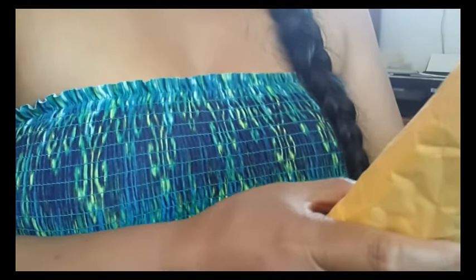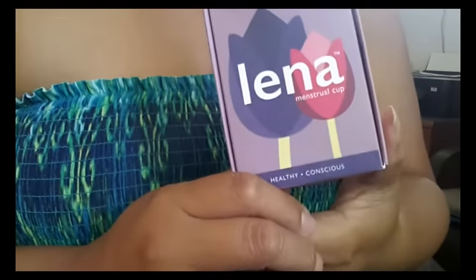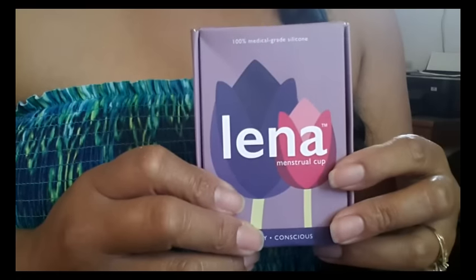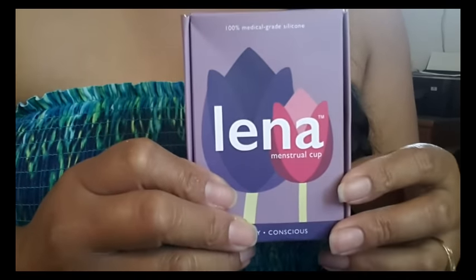I went ahead and opened the package and also cut the little sticker on the box but I didn't open it completely. Here is the inside and here is the box for the Lena cup. I didn't get a receipt or invoice or anything, but the Lena cup was $24.95. I bought it on Amazon and I had a share coupon for 15% off. My total after the discounted price was $26.21.